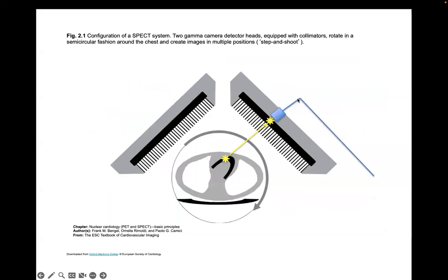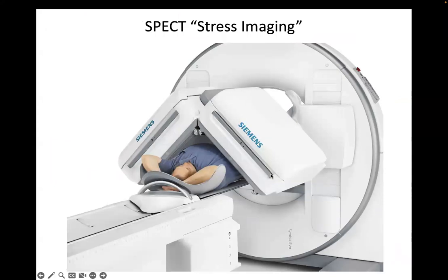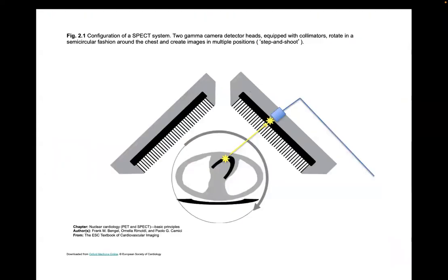And the basic layout of that thing is you have the sodium iodide crystal here, and then this would be the photomultiplier tube, and then a pulse would come out of here when an event occurs, and you have a set of these lined up along here. They're all about 1 inch in diameter, so you can imagine something that's 50 centimeters around, because we saw, here's the detector here, right? So it's that size, and you have photomultiplier tubes about 1 inch in diameter spread out over this whole thing under here. That's how many you've got.